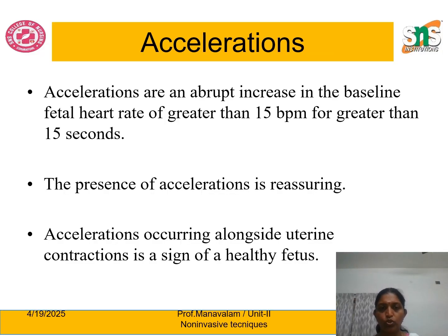of cardiotocography. In this, we are going to see certain parameters which we measure during cardiotocography. Mainly we are going to concentrate on the acceleration of the fetal heart rate and the deceleration of the fetal heart rate, as well as what is a sinusoidal pattern. First we will see what is acceleration.